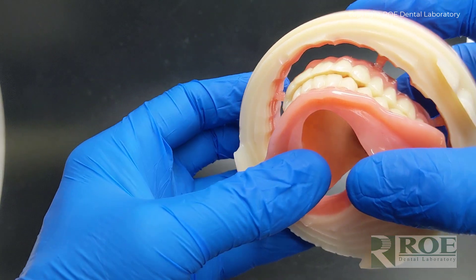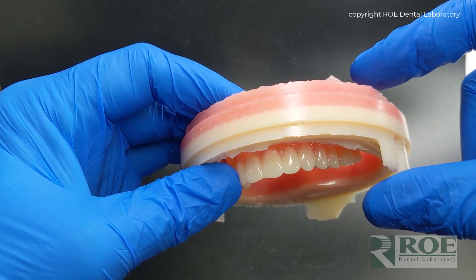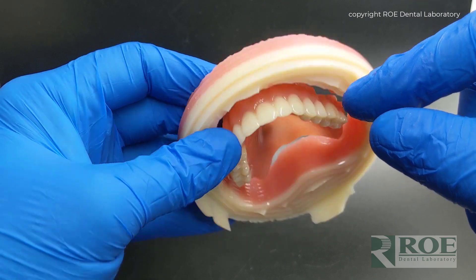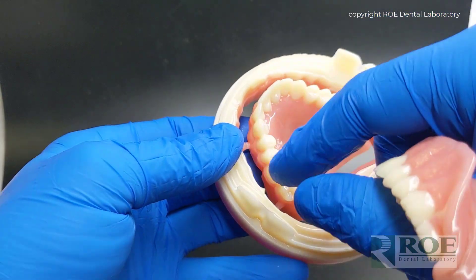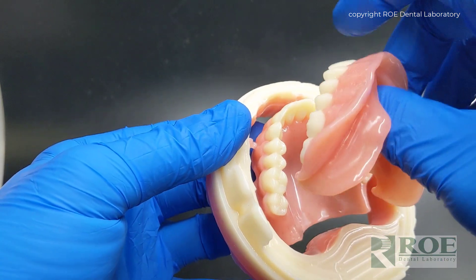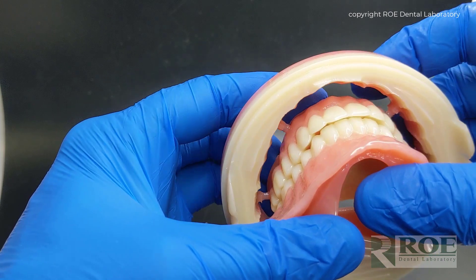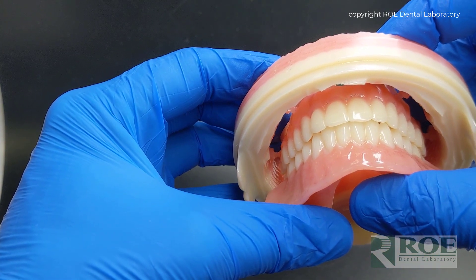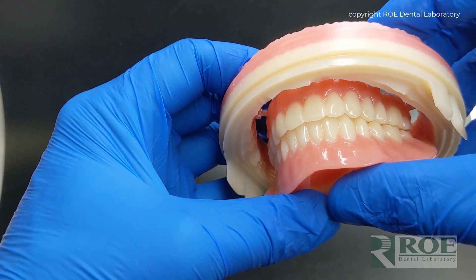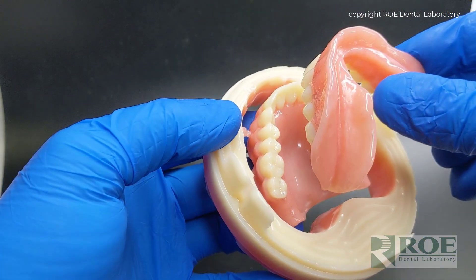95% of patients fit within this puck. Within the confines of the puck, the teeth that we set, the scalloping, and the tooth molds all fit. So it's a pretty amazing product. This is Ivotion from Ivoclar and ROE Dental Laboratory mills them.